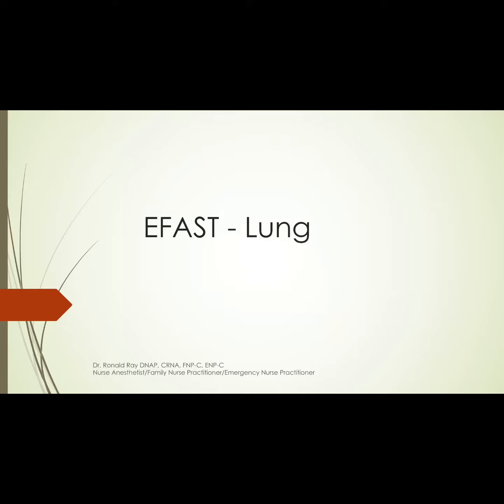This one is a continuation of the EFAST exam series, and we'll be on the lung. As I mentioned before, ultrasound is much more sensitive for picking up pneumothorax as well as pulmonary edemas, pneumonias, etc. than chest x-ray is. And it's much easier, much faster. Pretty much all trauma patients should be getting this done for them, as well as a lot of the medical patients that you may have.